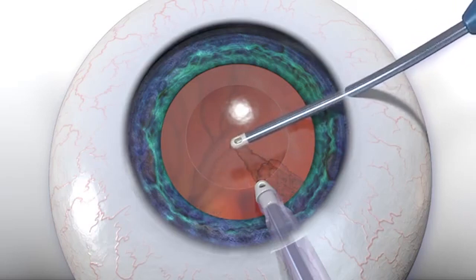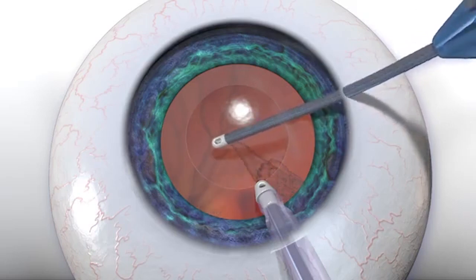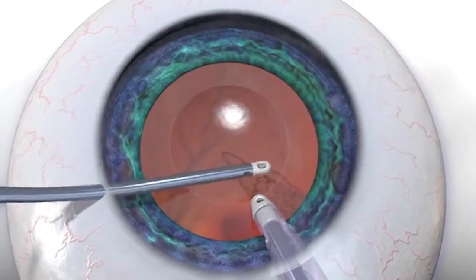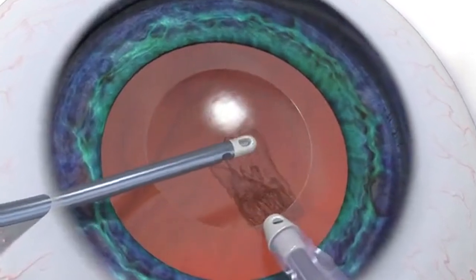Capsular polishing can also be performed with the polymer-tipped bimanual aspirating port. If needed, the aspirating handpiece can be switched to the other side to access any remaining cortex.